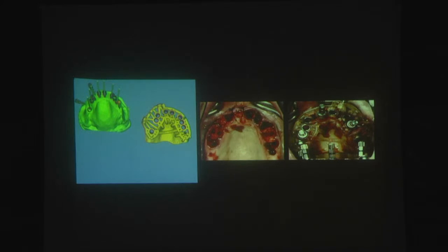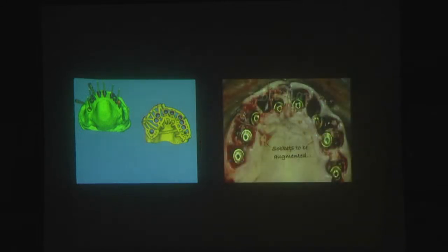We did the extractions very kindly and in a non-traumatic way. And after the extractions, we cleaned the inner parts of the socket very deeply, and it is more important than everything. Then we placed 8 implants in the extraction sockets.